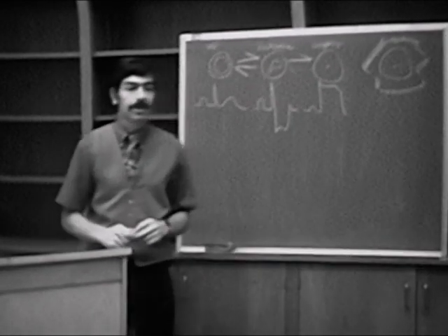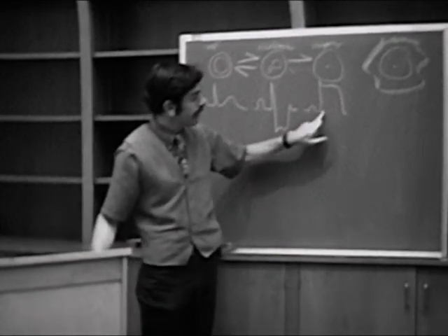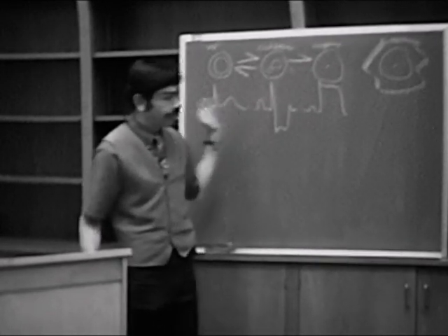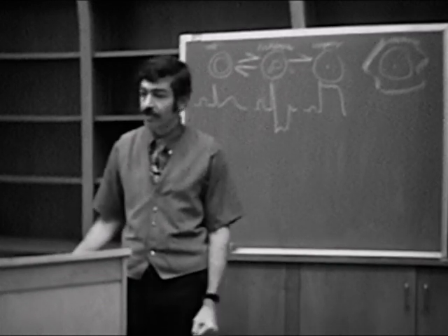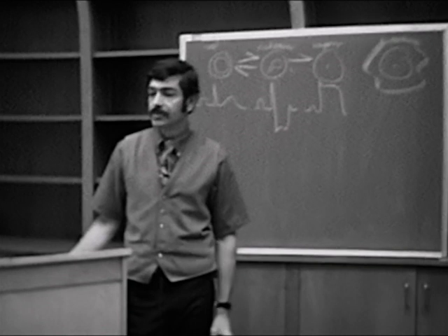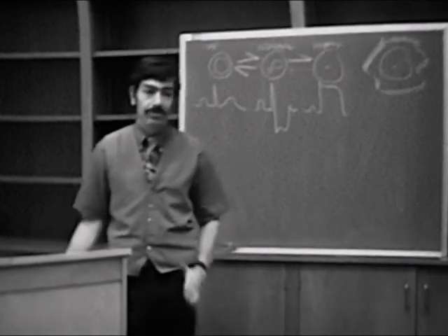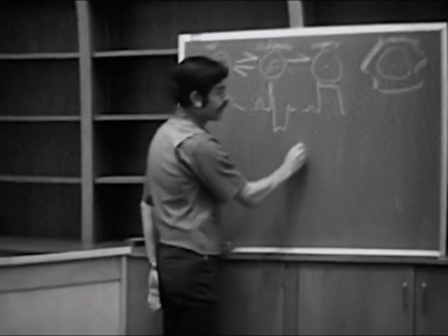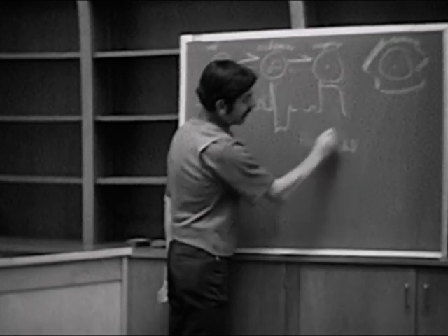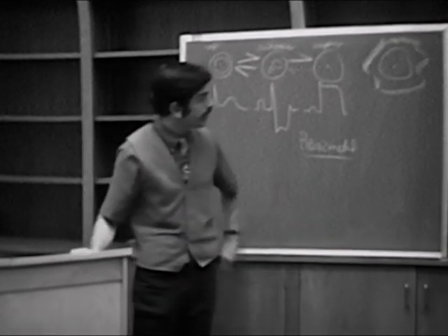As a matter of fact, there's one type of angina where patients develop this pattern in their EKG instead of ischemia, and then they return to normal. They develop this type of tracing during their episodes of angina. What type is that? Anybody heard of that? Right, this is Prinzmetal variant angina, named after the man who discovered the entity.